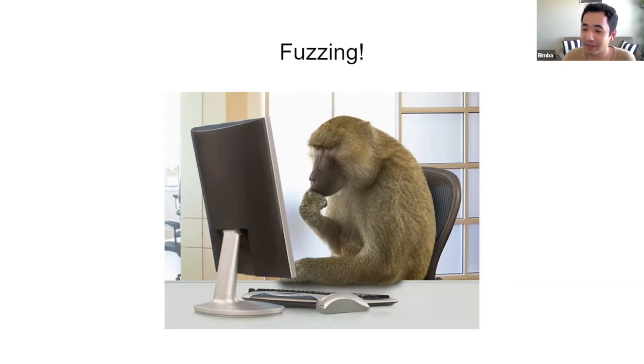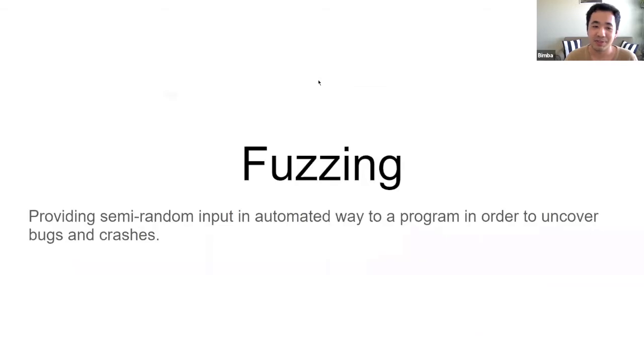Like randomly sending data to an application to see how it handles it? Yeah. That's exactly it. It's just providing random input to a program, trying to break it, and then recording when it gets broken.